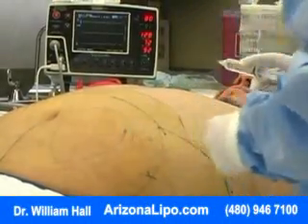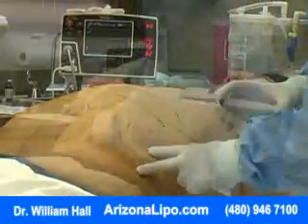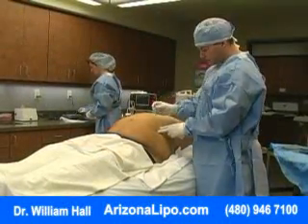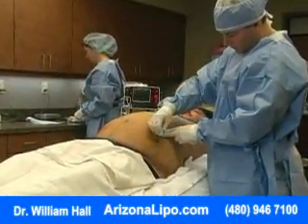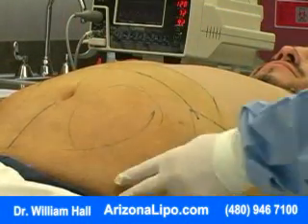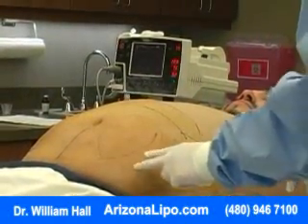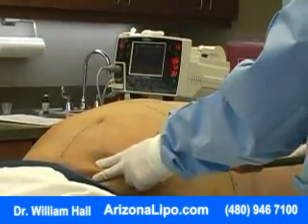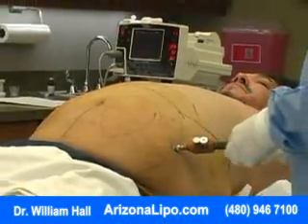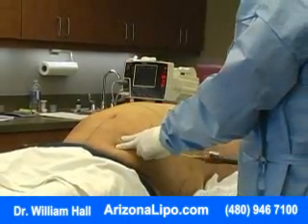Okay, Alex, so we're going to just put tiny little injections where I'm going to put my incision sites, okay? You'll barely feel this at all. So 4 total on the abdomen. And you'll mostly just feel a little bit of stinging sensation here and there, but not too bad, is it? No. This is the combination of the local anesthesia, the salt water, and the epinephrine that we talked about. So it's doing 2 things. It's numbing the area so you're not going to feel anything when we do the suctioning, and it's also constricting the blood vessels so that there's hardly any blood loss in this procedure.